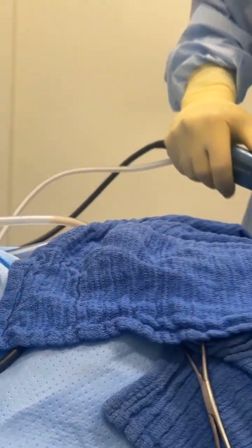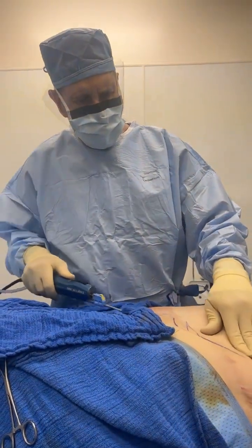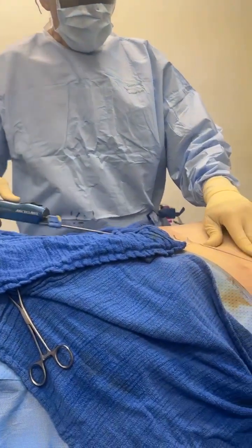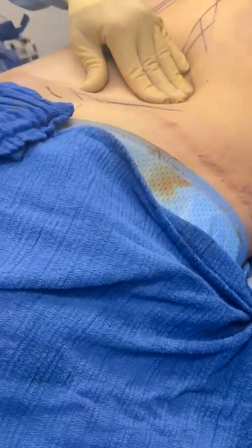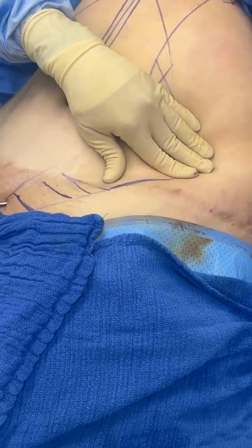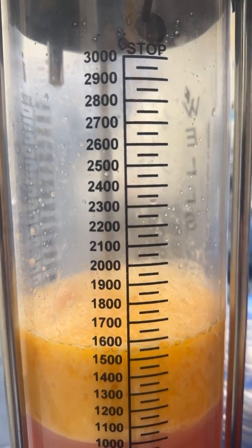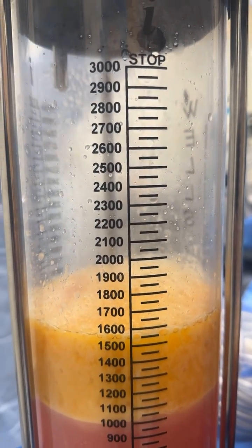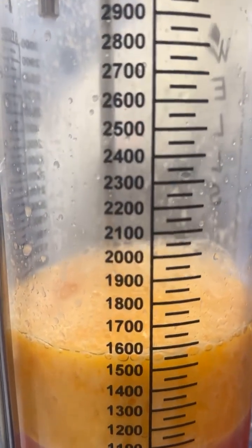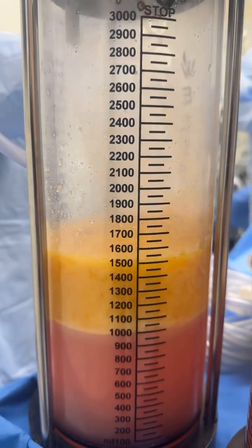And so I believe that how you collect the fat is very important, and how careful you are with the fat graft. And you'll see when we inject this fat that it's going to be this very yellow, beautiful fat that we are obtaining now here. It is the same fat that's going to go into her body. Thank you. So notice how we're still getting a very nice fat, and the infranatant is just lightly pink. I'm going to let it go and you'll see how the fat goes in there.